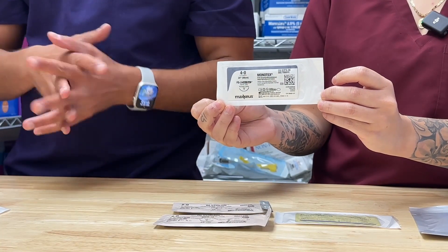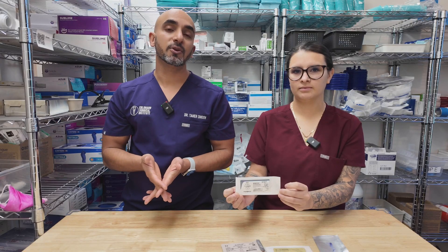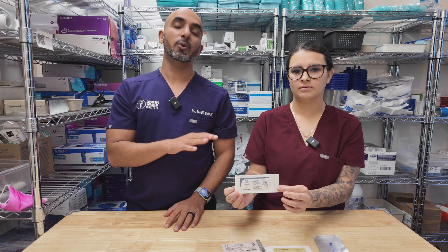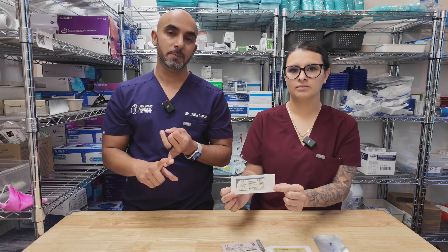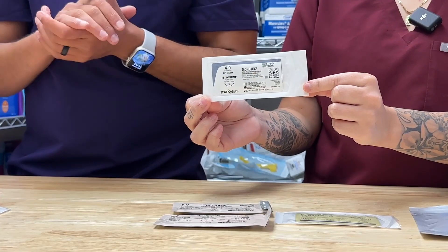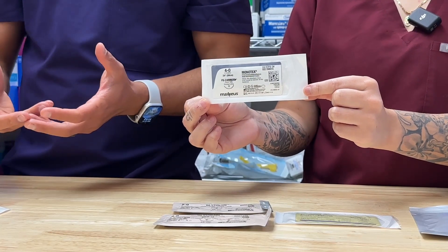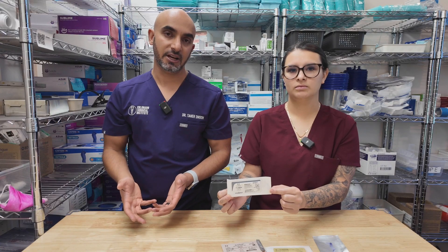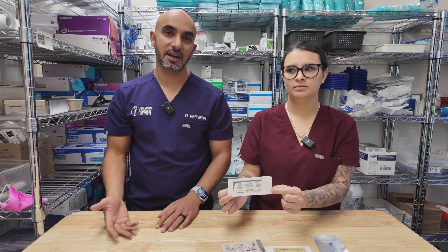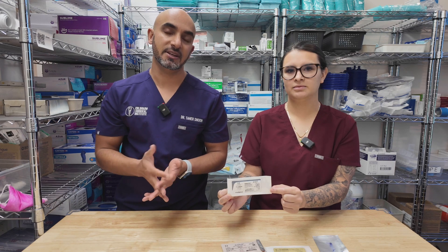Our next suture is going to be PTFE — Cytoplast, PTFE, whatever you want to call it. For the vast majority of cases, we're going to use a 4-0 on that. Typically, I'm only using this on socket preservation, single implants, or quadrant-based dentistry. I'm not using it in wisdom teeth because it can tuck under the tissue — it's non-resorbable, and you don't want to go in there and try to fish it out later. If it's under a prosthetic, it's a nightmare. So you don't necessarily want to use your Cytoplast or PTFE there either.